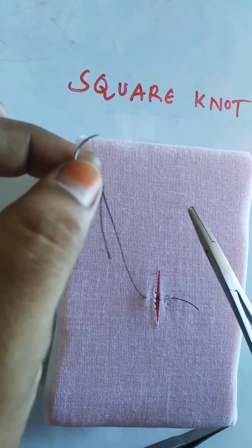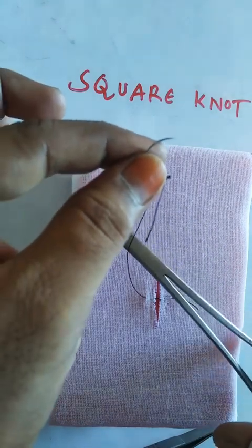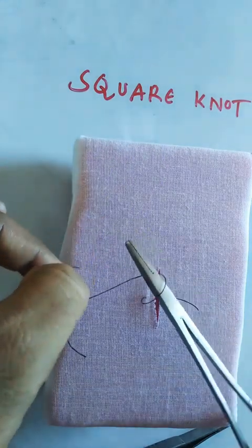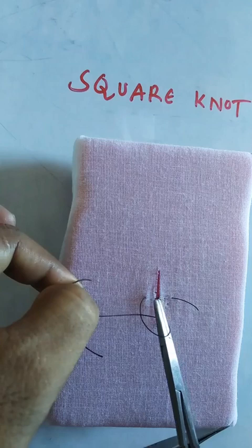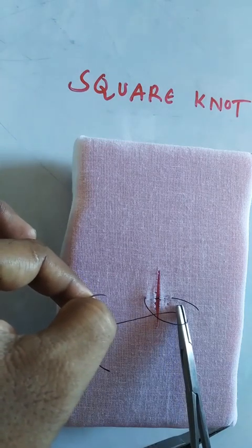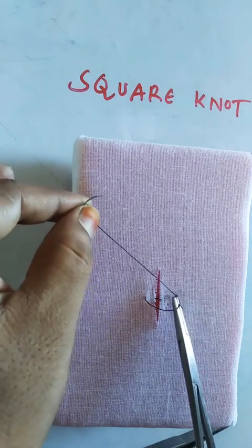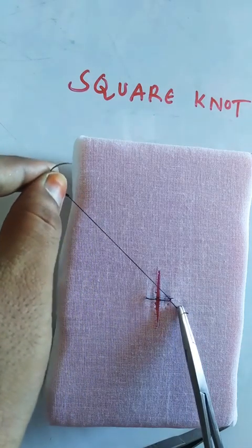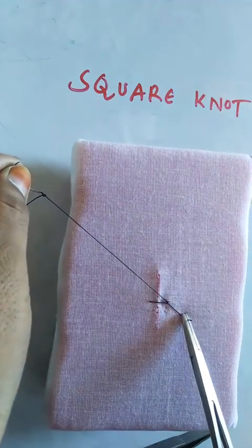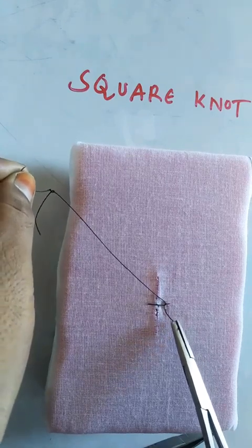So I will pass this long end of the suture material around and above the needle holder like this, and I have made a loop. Then I open the needle holder and grasp the short end. Then I pull it through the loop and make a knot like this. This is the first knot.